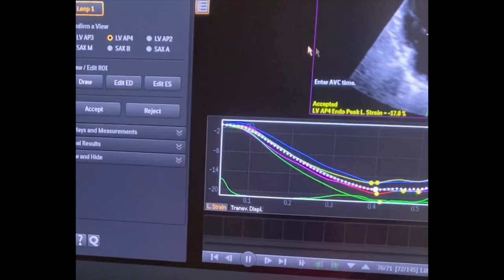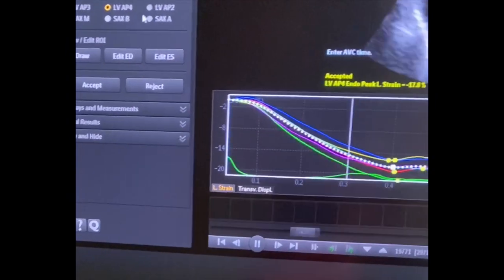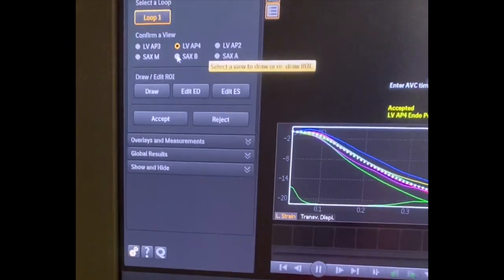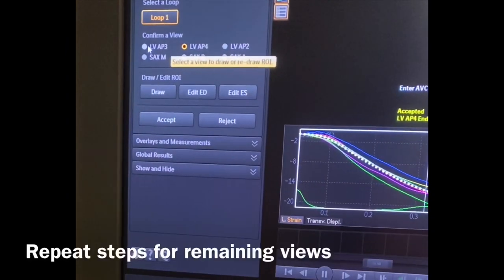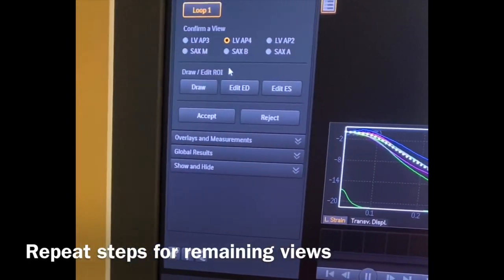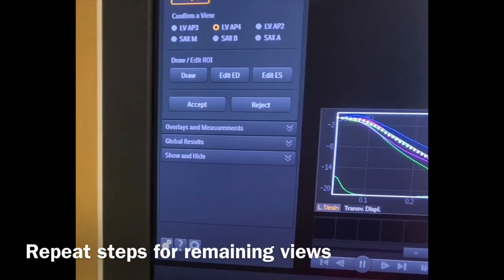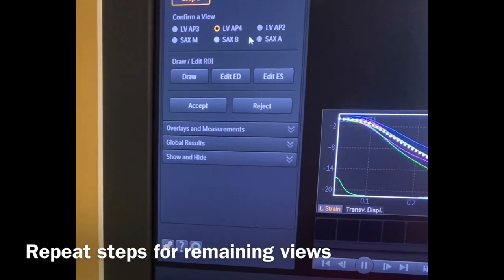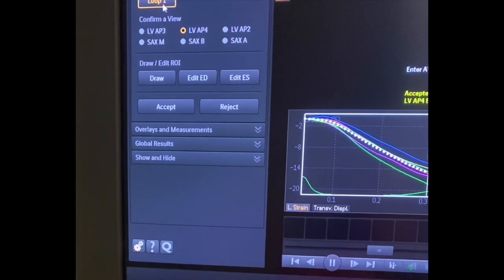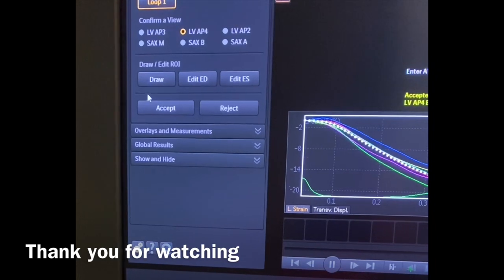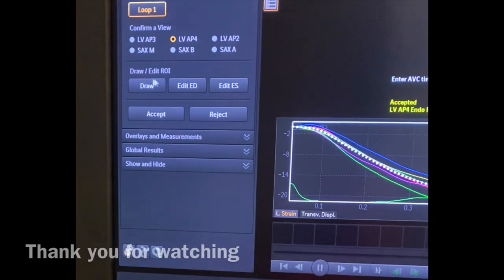Now that I've got my Apical 4 done, you do the same steps for the 2-chamber view and also the SAX view for the complete analysis of strain. Thank you.